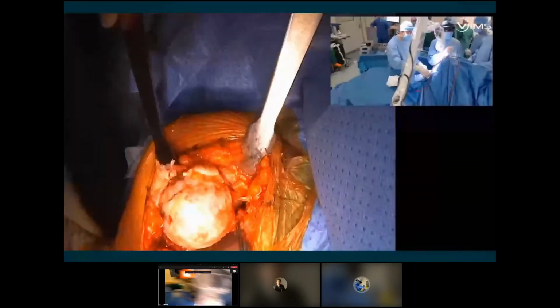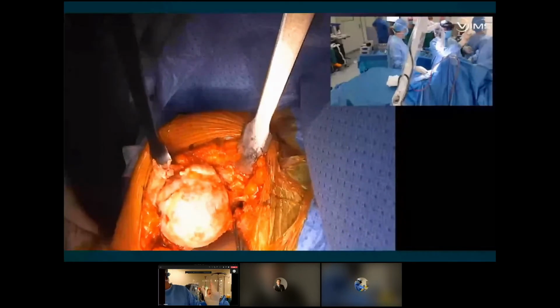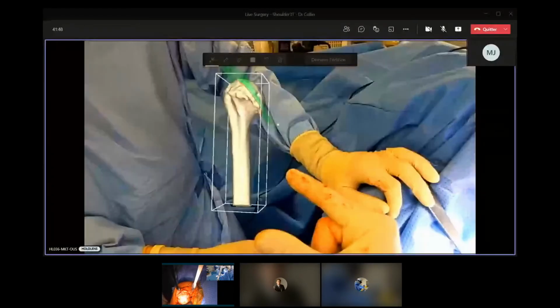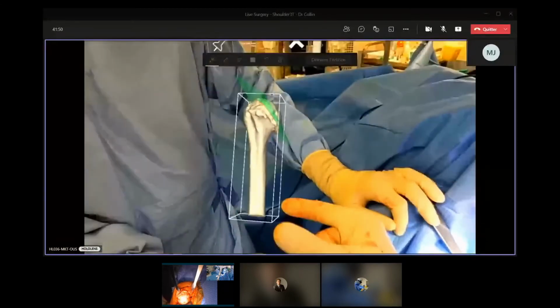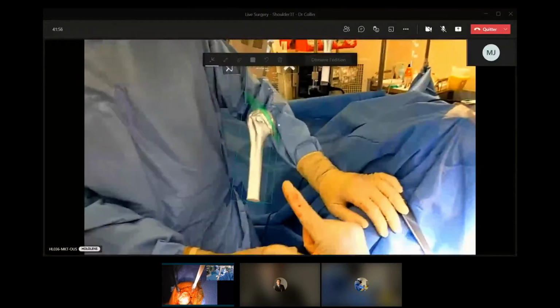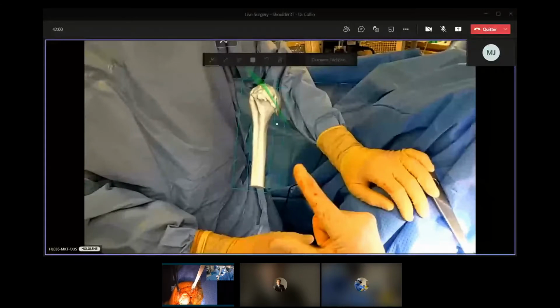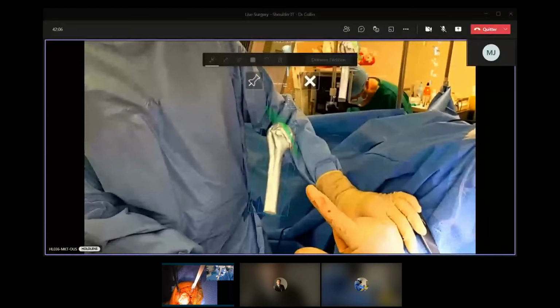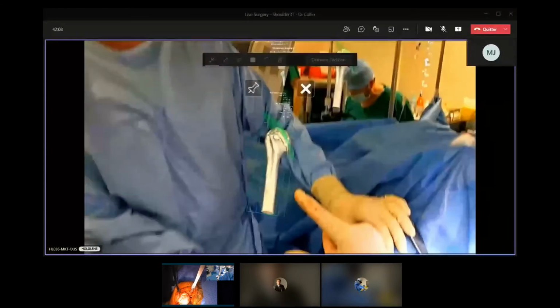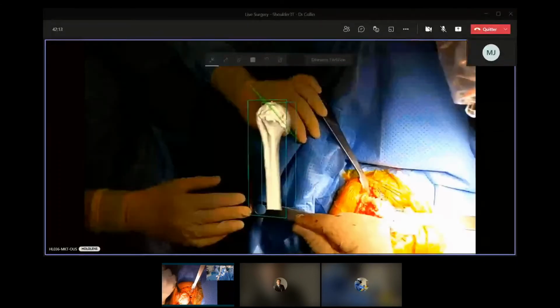So let's turn to why you are here today. You go to humerus, you start clone view. You need to ask for a clone view. And then I will have it here. You can see it? So normally it's here. Normally I can tweak it, but okay, c'est bon. So est-ce que vous voyez my hologram here?